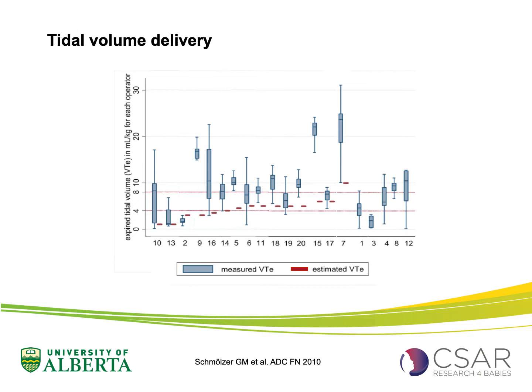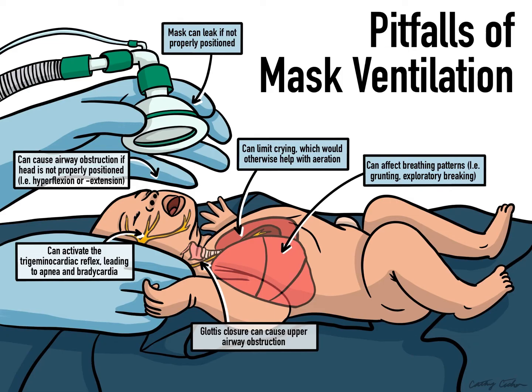So it is really hard for you to be on top of the game and always identify how much volume goes in, particularly when you use a T-piece. Now, people will say, oh, well, we use a flow inflating bag, we can feel that. And I can only say that might be true. Unfortunately, there is an extreme lack of studies using a flow inflating bag, as no one has ever performed any of these respiratory function monitoring studies using flow inflating bags.